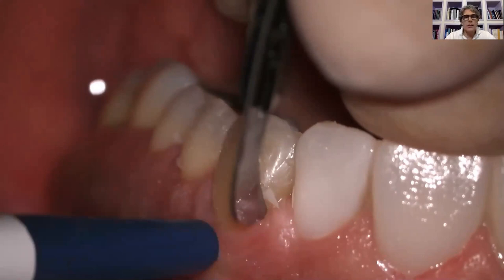Before doing that, it is necessary to redefine the mock-up, eliminating all the excess of resin with a diamond bur from the palatal surfaces of the frontal teeth involved in the treatment, and also using a scalpel blade, as you can see from this image, with which I remove the excess of resin from the cervical areas. This concept is very, very important, because in this step I have to copy the morphology of the mock-up, sharing a good morphology with the software CEREC.